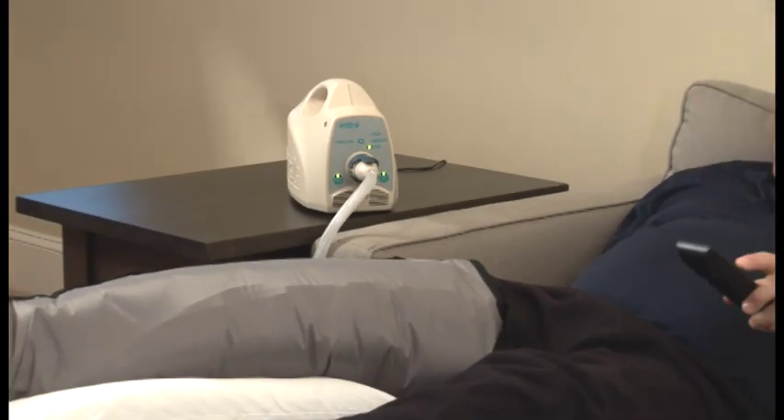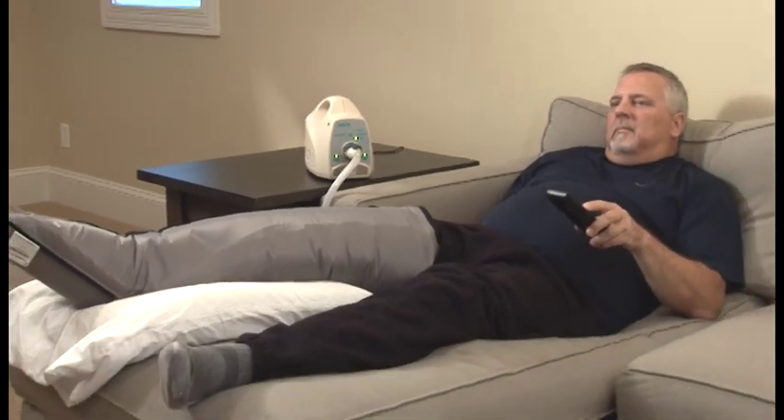The compression garment has eight chambers that inflate sequentially from the toes or fingers of your treated limb towards your body, in order to effectively move excess fluid from swollen extremities. ENTRE is easy to use — just follow these seven simple steps.